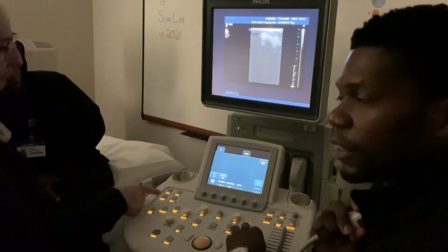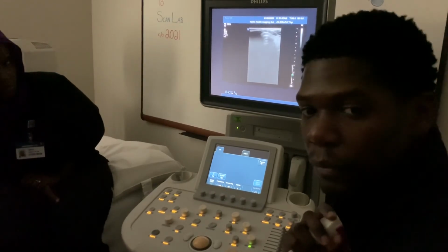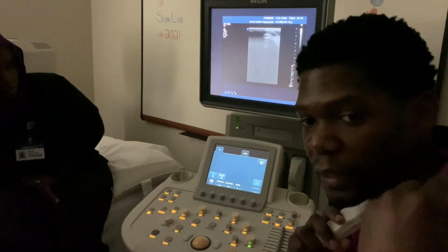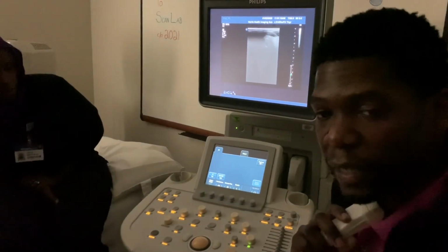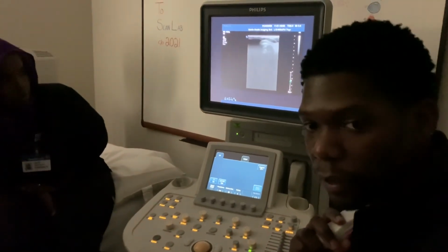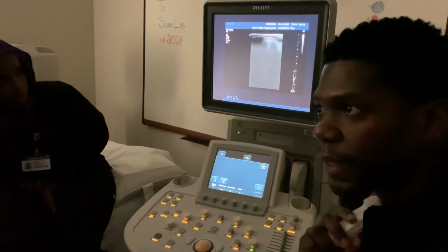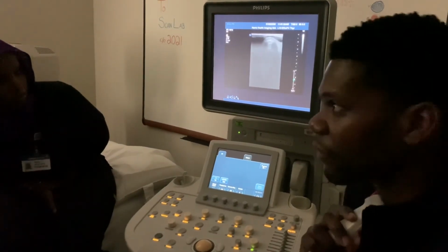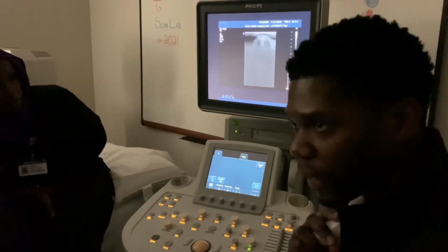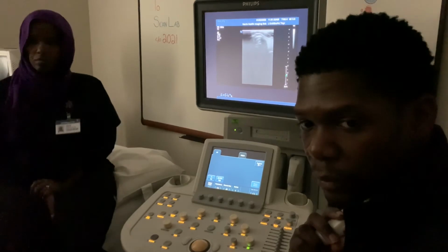Okay? Because of attenuation. When do you use that? What output power? If my image is too bright, I want to decrease my output power to decrease the dose to the patient. Okay. If my image is really dark, then I don't want to turn up my output power. I want to turn up my gain because that's a receiver function. It doesn't affect patient dose. That's the number one thing about transducer output is that it affects the patient dose. Okay. But we rarely mess with that.